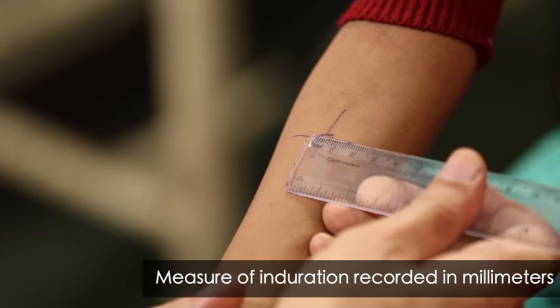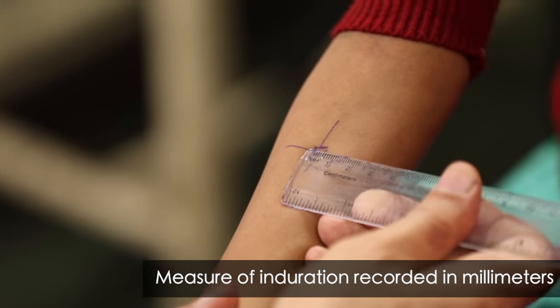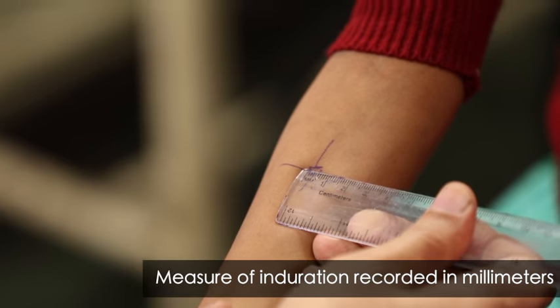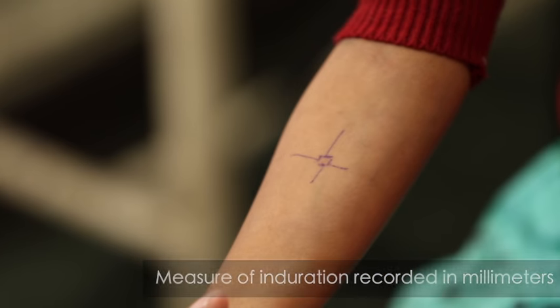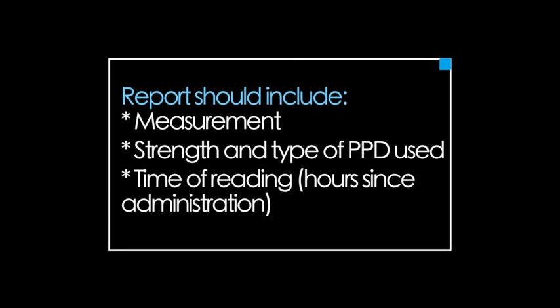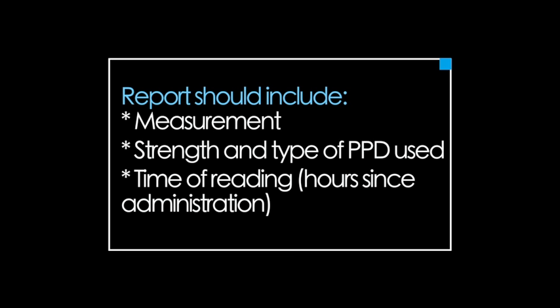Record results in millimeters of induration rather than as positive or negative. Additionally, report the type and strength of PPD used and the time of reading from the time it was administered.